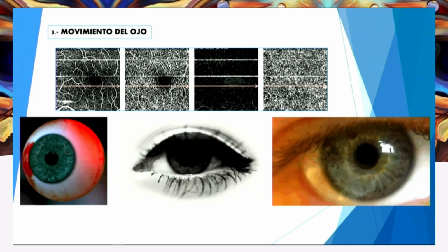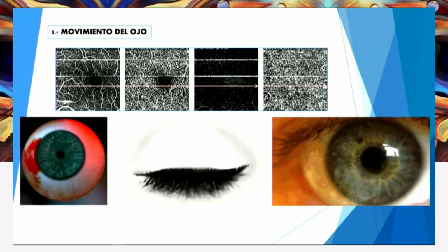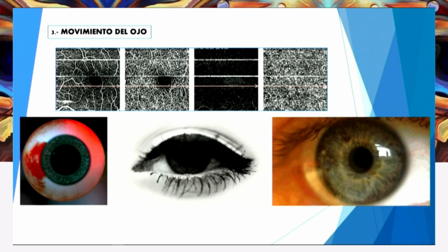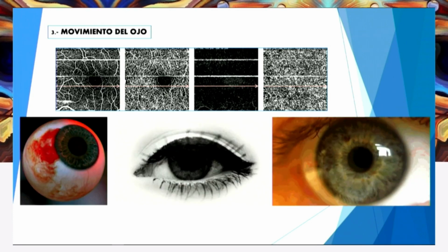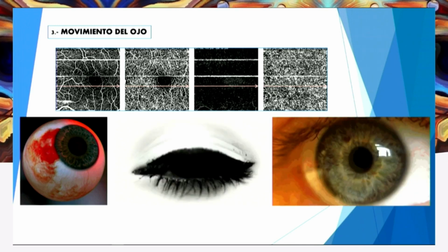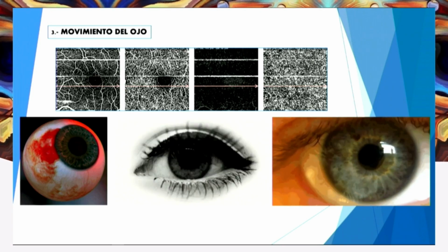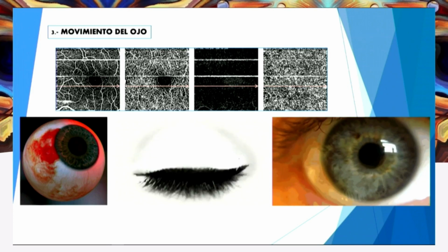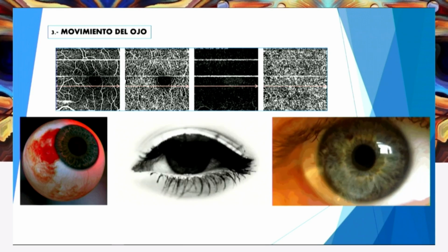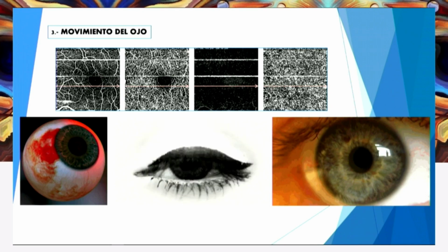Well, another cause, normal eye movement. An uncooperative patient with constant blinking. Optopol machine asks patients to blink normally, and it seems that precisely at that moment, patients end up blinking permanently, so that's no longer normal blinking. And that tends to happen. We might have nystagmus disturbances, and therefore have these artifacts that result from that.